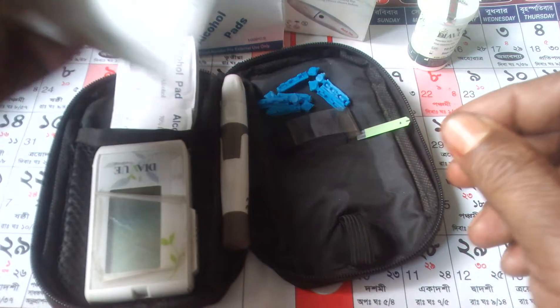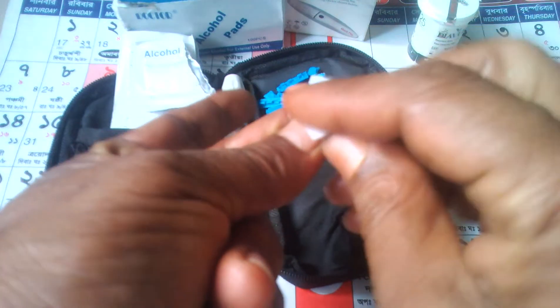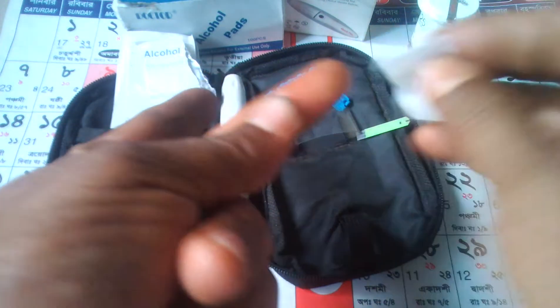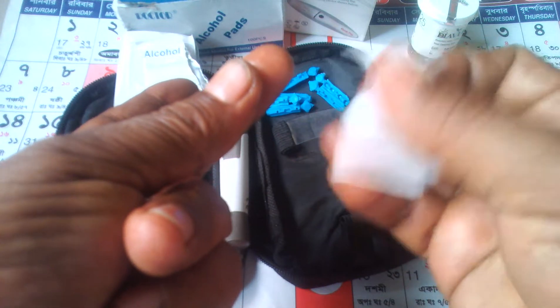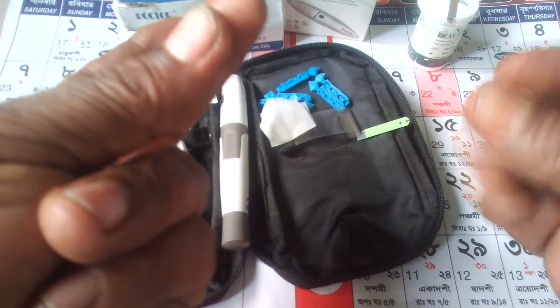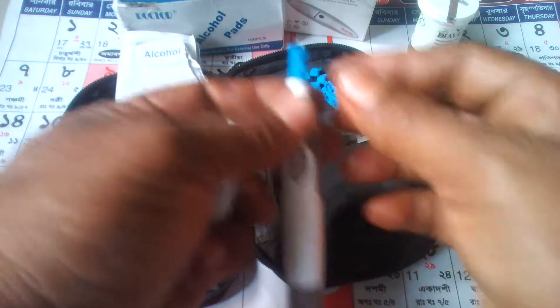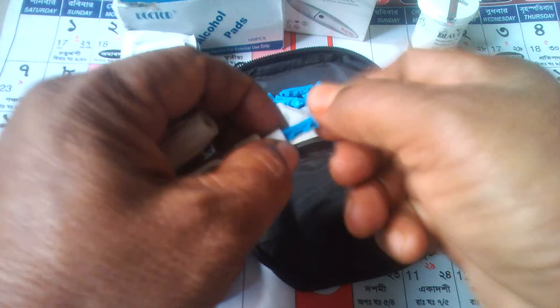First, just wash your finger. After, set the new lancet at piston.